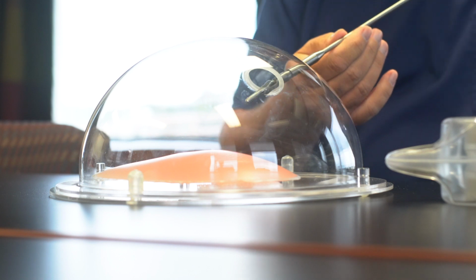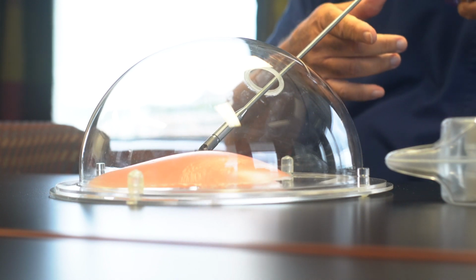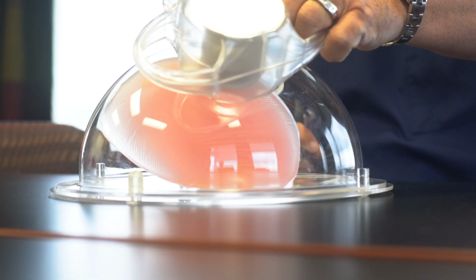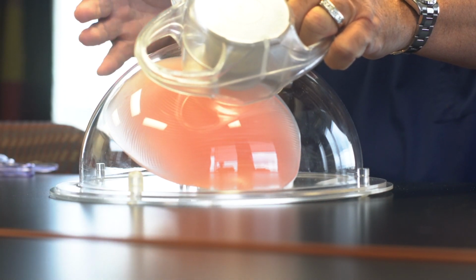So let's make believe this was someone's abdomen, and we were picking a piece of tissue up. We needed to move it over, lift it up out of the way. We can do that. We go in, we take that, find it where we want it, then we bring the magnet in on the patient's abdominal wall, and then we deploy the magnet. So here we've moved tissue out of our way, deploying our magnet, exposing the area that we want to operate, because as you know, the stomach lives beneath the liver.